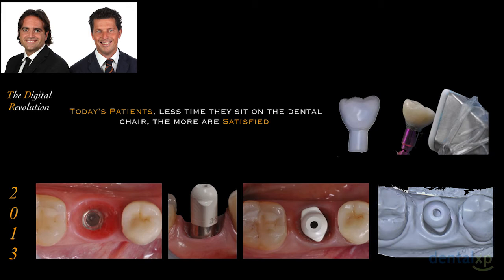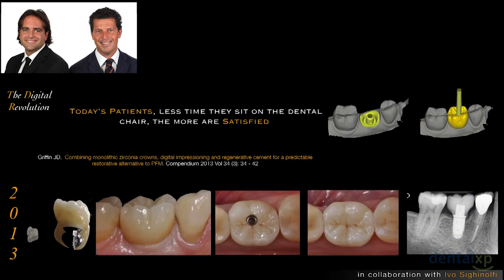Because thanks to the digital solution, we can not only replicate the soft tissue tunnel, but we can also replicate the function of the patient. And this is what we did in this case. Thanks to lithium disilicate, we were able to restore in 1 day once the implant was integrated, by taking the intraoral impression, taking the scan of the provisional, and then going for the final restoration in 1 day. So this is important. But what is also important is not to lose the final quality of our product.